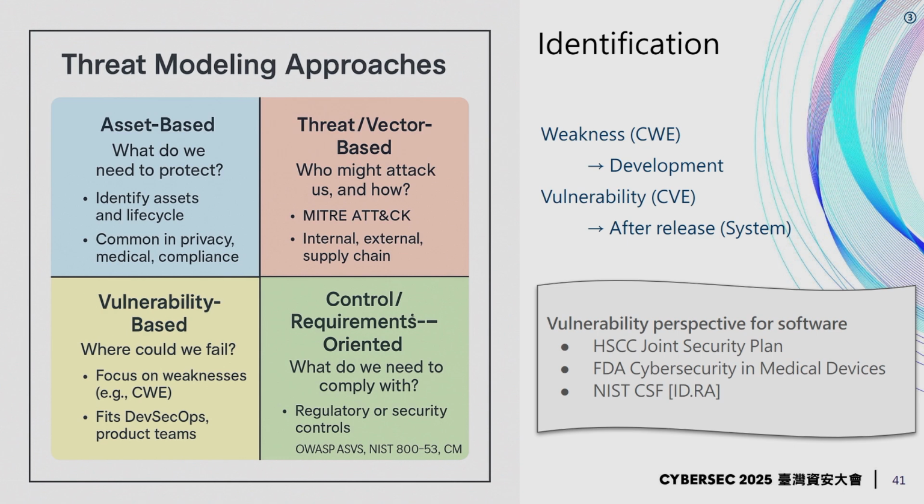All right. So let's move into the risk identification, to produce a complete and defendable list of risks. There are multiple perspectives to approach this task. You can look at it from the asset perspective, or from the threat actors, or from vulnerability, or from a control perspective. From a software perspective, it's usually highly documented to look at it from a vulnerability perspective, and there's a few guidance documents that discuss that.